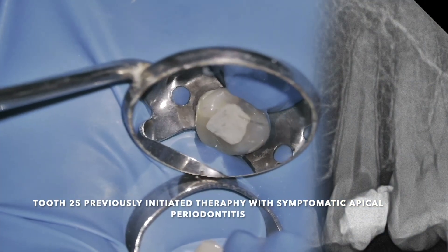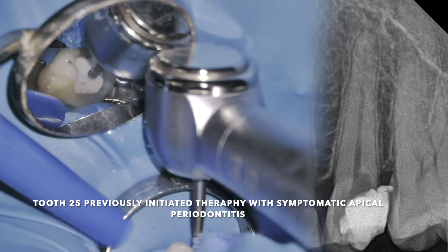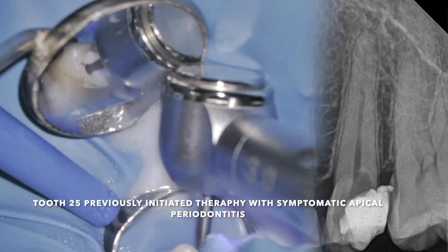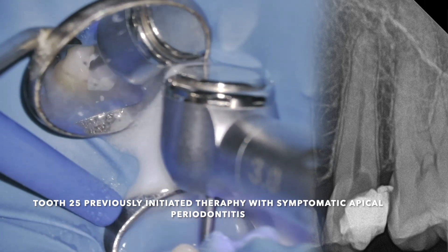Today, we are focusing on a clinical case involving tooth number 25. The diagnosis is previously initiated therapy with symptomatic apical periodontitis.